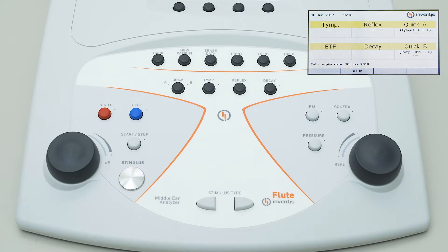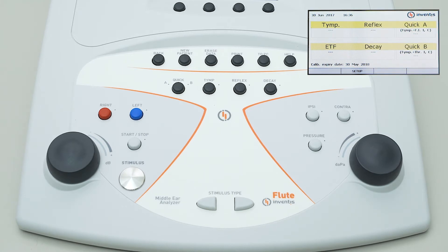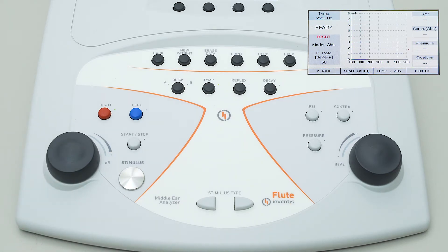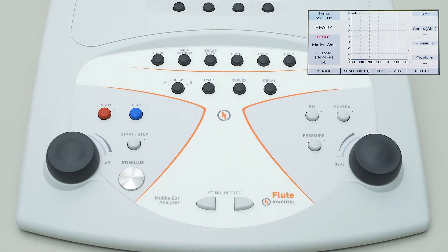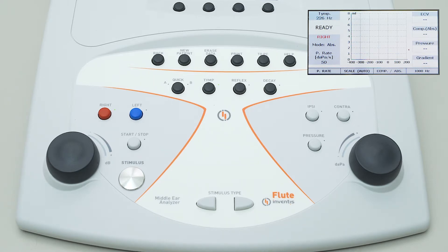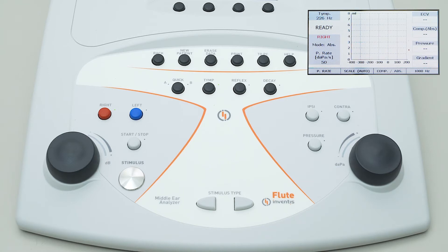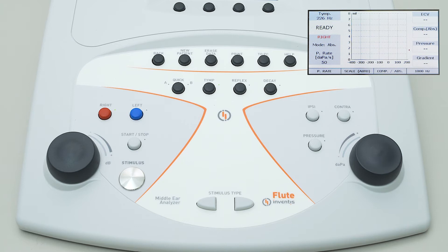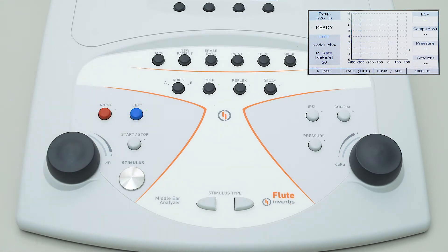To conduct the tympanometry test, the operator should simply press the dedicated button on the keyboard. The frequency of the probe tone, the status of the probe, and the progress of the test are indicated at the top left of the screen. Lower down, the screen shows information about the stimulation side and the visualization mode: compensated or absolute.